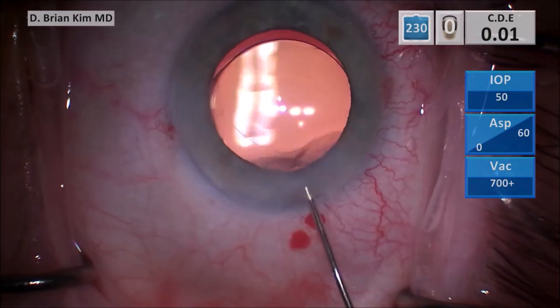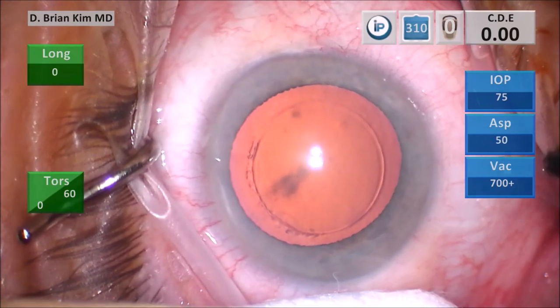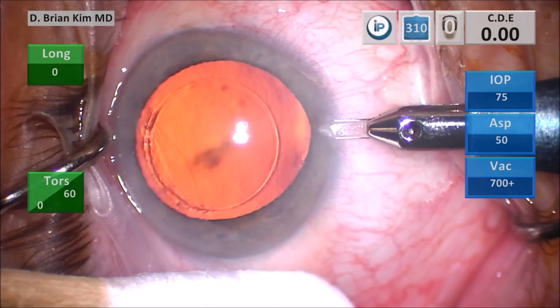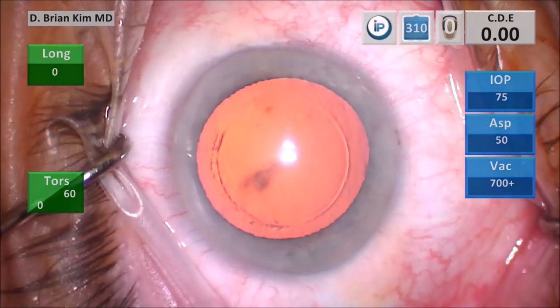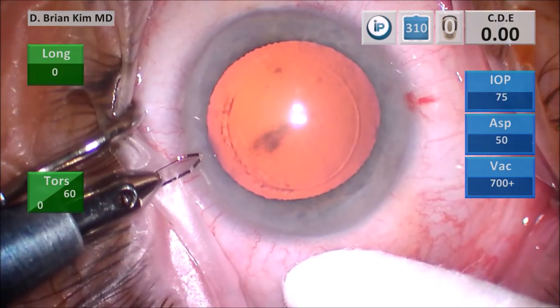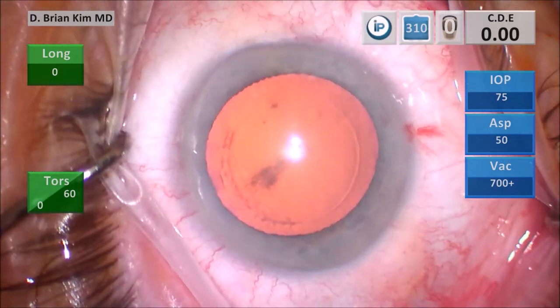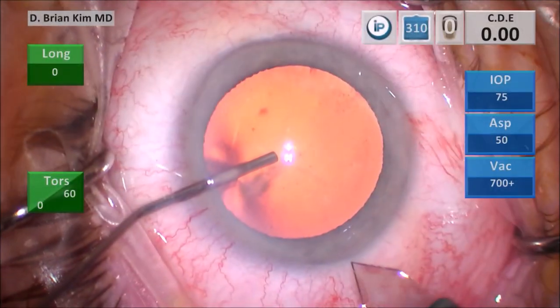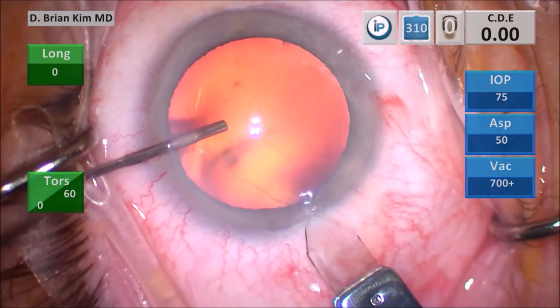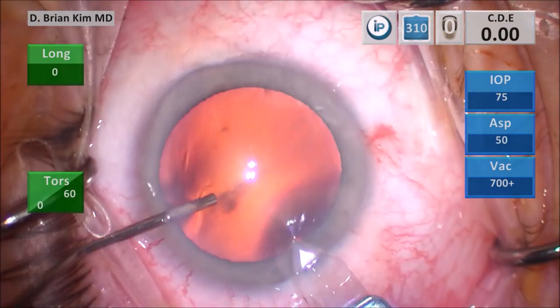Don't use such vigorous pressure that you're going to cause a problem. Here's another case: using the cotton tip, pull the eye to the left — this allows you to approach the blade parallel to the iris plane and get a nice rectangular incision. Pull the eye to the right and with the left paracentesis blade create a nice planar level incision, again level to the iris plane. Fill the eye with viscoelastic, make your vertical groove, place the tip of the blade through the deepest part of the incision, tunnel, get to the desired length, and then enter into the anterior chamber.